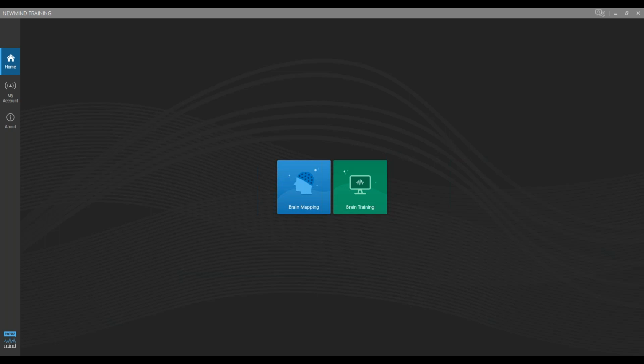A couple times I tried using my Cardia near it, and it's telling me there's electrical interference. So that's something you have to watch. If there's any hot cord coming from the computer or near the person, even if their cell phone is on, I don't know how sensitive the equipment is, but that can be picked up.